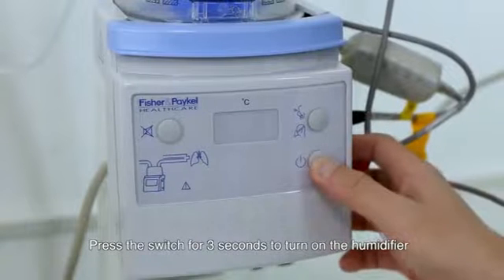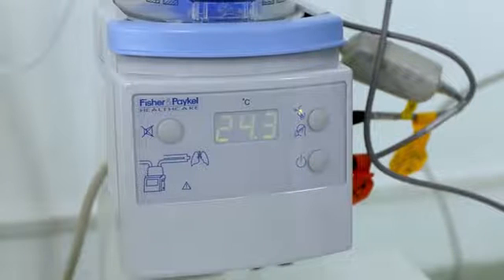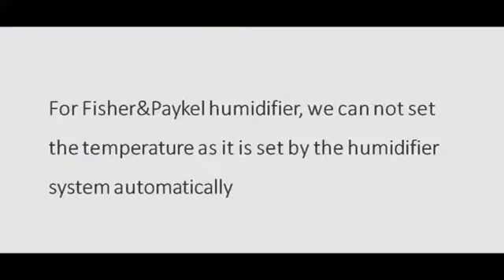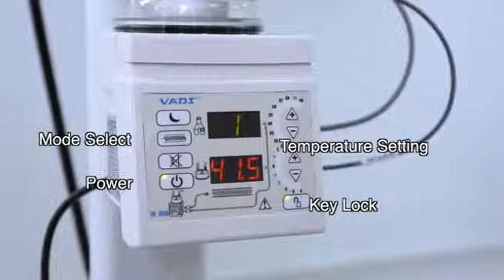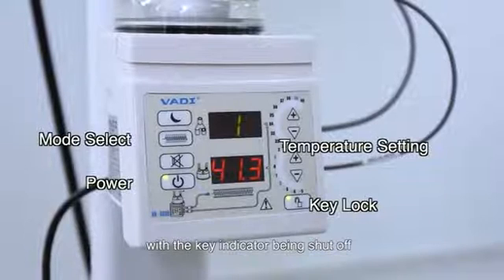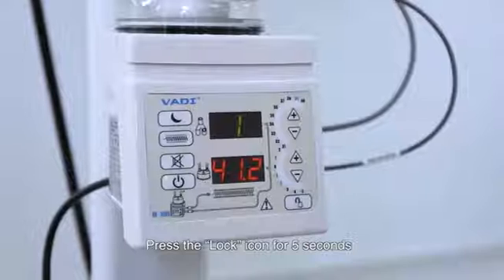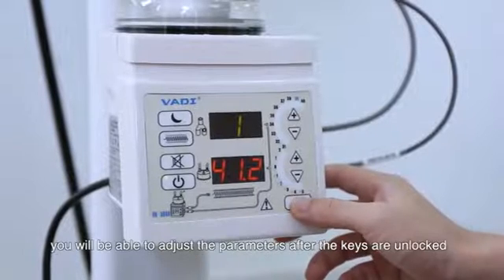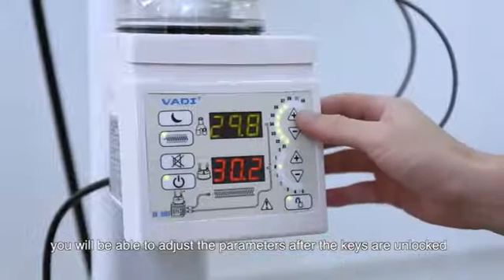Press the switch for 3 seconds to turn on the humidifier. Turn on the VADI humidifier. After 5 seconds, the humidifier will be locked automatically with the key indicator being shut off. Press the lock icon for 5 seconds. You will be able to adjust the parameters after the keys are unlocked.